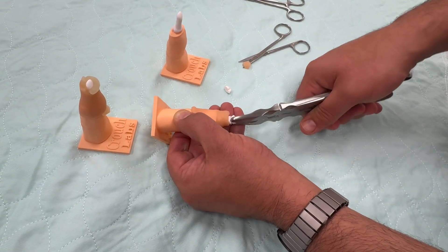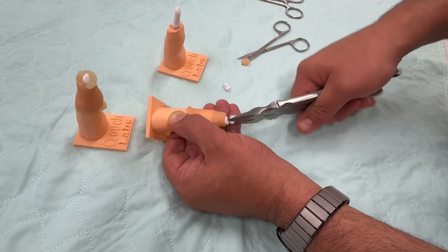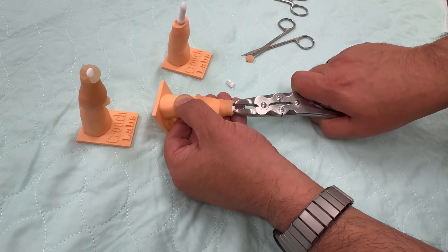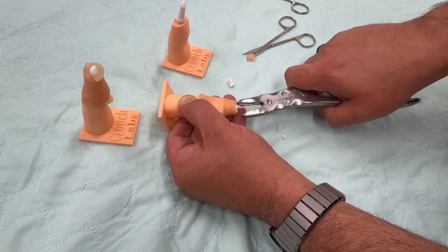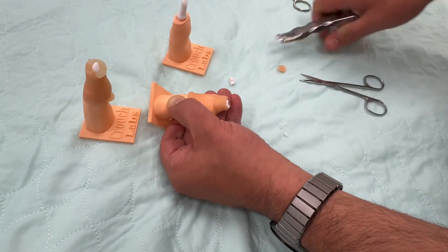This will often take multiple bites and multiple attempts, but you can cut the silicone as needed — either a very small piece or a very large piece — to give you an idea of different feelings of how much bone you would have to resect, grinding down that distal phalanx. It will kind of splinter and break very similar to real bone.